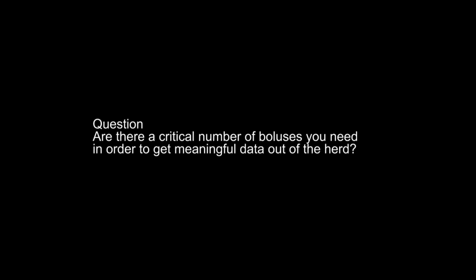Occasionally boluses will fail. We're continually increasing the quality of production so that doesn't happen very often, and we're constantly fault finding, so occasionally you will get dropouts. So you need at least 3 really in any particular group, because you can draw a line through 3 points. You can't really draw it through 2 points realistically. So we'd say 3 per group. But if you've got 150 cows in the group, you've still only got 3 boluses in there.